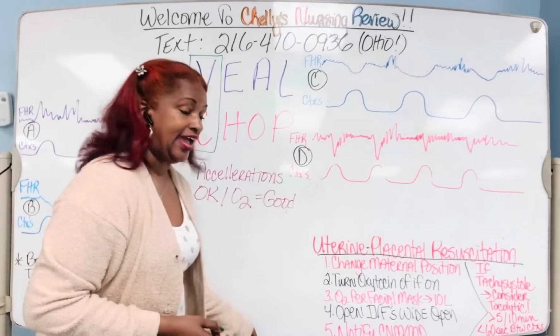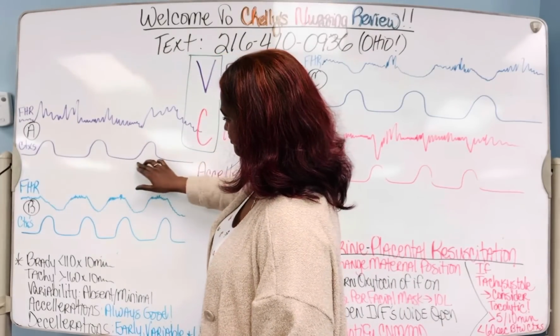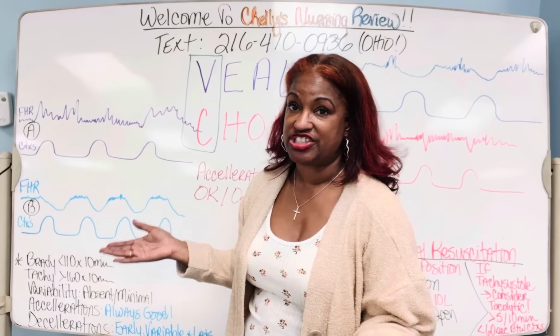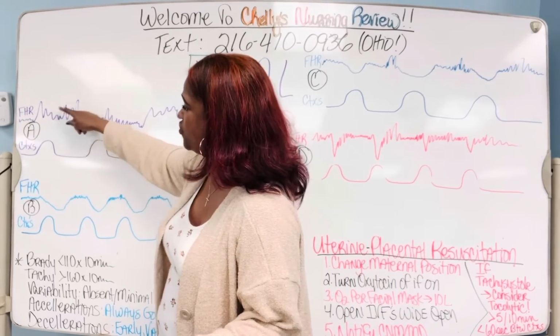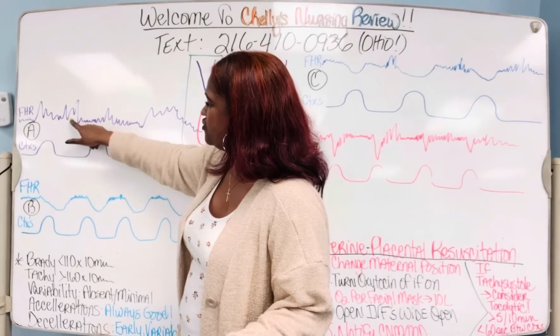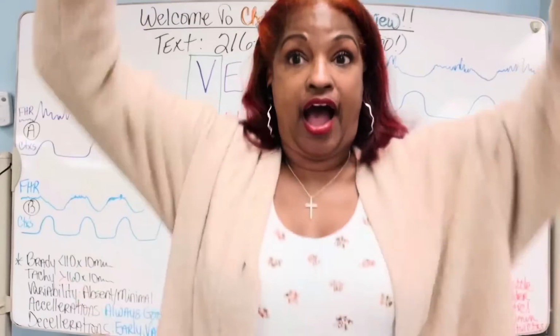Here we go. Contractions are here. And let me just say, you don't have to have contractions to have fetal heart rate accelerations. But in this patient, they're in labor. Their baby has heart rate accelerations with or without a contraction. Let me show you. Here's an acceleration. Here's an acceleration. Here's an acceleration. Here's a great big acceleration. They're all fine. It's going up, right?